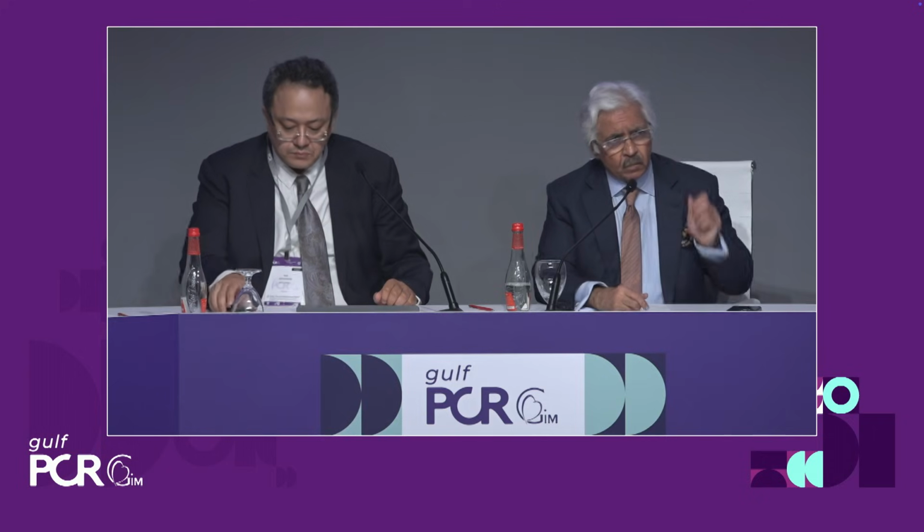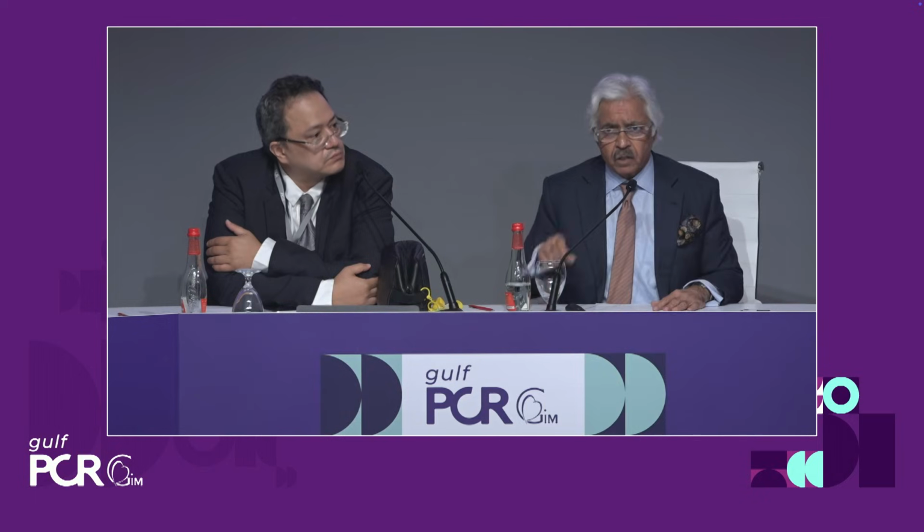With those words, I think we're ready to wrap up. I think this has been a great session. In fact, it's been a privilege: it was 2018 when at PCR, I presented at the late-breaking trials the Myval 1 study as a principal investigator. In 6 years, we moved the clock in a huge manner, with some of the greats sitting around this table and in the audience, where we saw tremendous cases from Myval, science, trials, prospective randomized trials, and of course, great experiences from around the table and across the world.